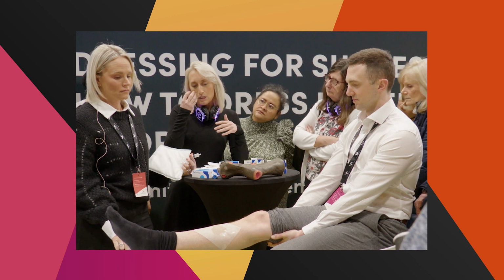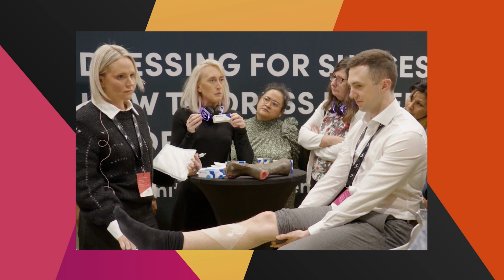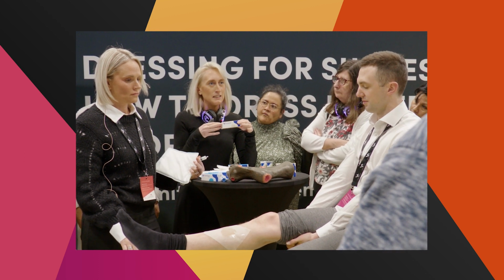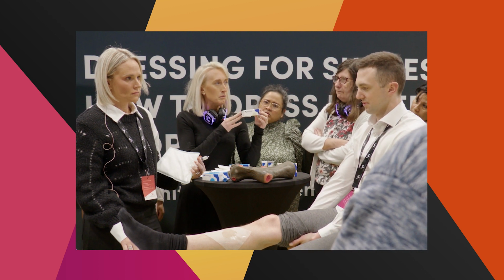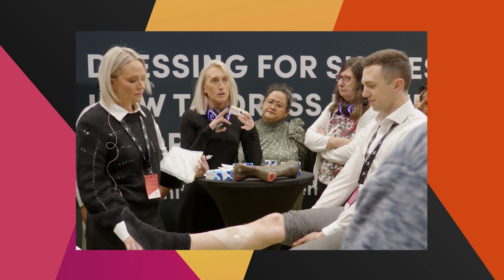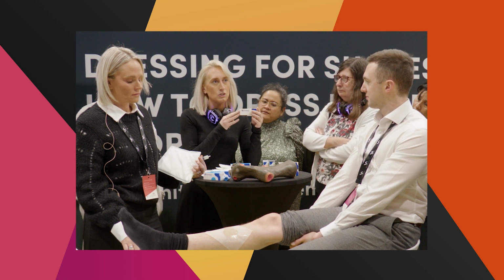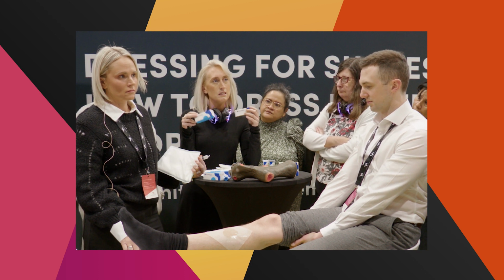The only difference between the two products is that in the Forte, we've added extra alginate. The reason that we've done that is to help deal with your higher exudate wounds. So for example, if Adam's leg needed the dressing changing every day or every other day because it was so high in terms of the moisture levels, you would start with your Flaminol Forte. Because you've provided the wound with an antimicrobial, you're constantly debriding it, and you've got your moisture balance there with the alginate, at some point this wound won't require such high levels of alginate. So at that point you can switch down to the Hydro and continue using the same treatment plan.